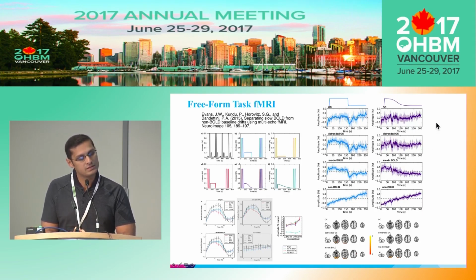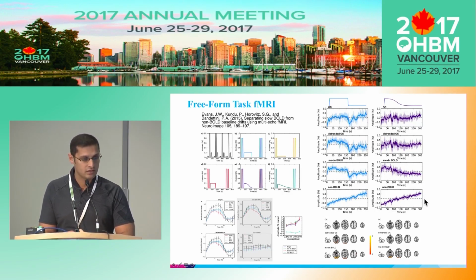It's just an example. The task here was a flashing checkerboard with varying contrast. And the multi-echo ICA approach was the only one to be able to find the sigmoidal change and disentangle it from a monotonic drift in the non-BOLD series.